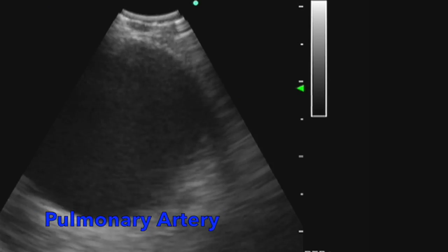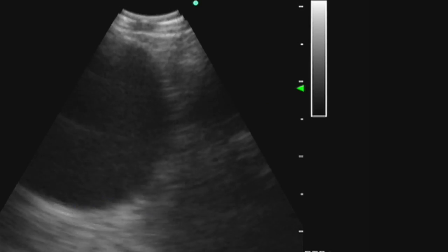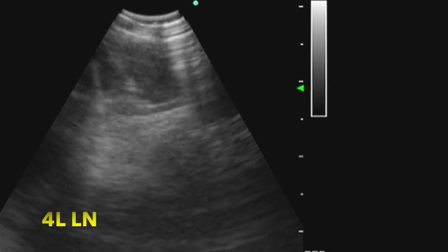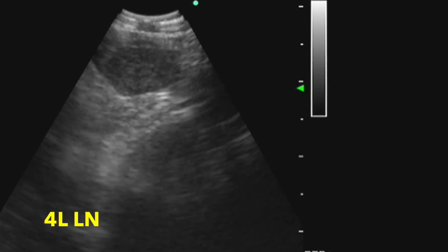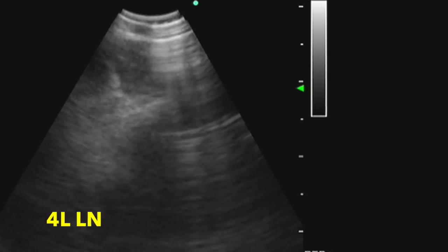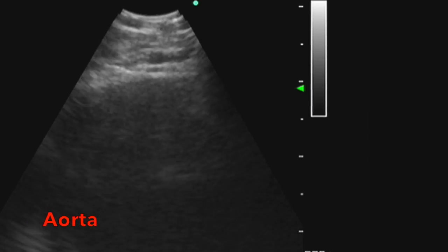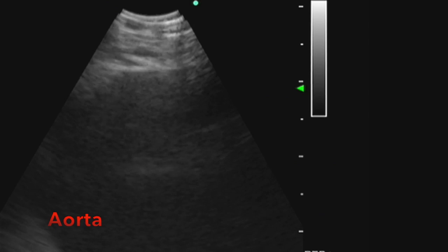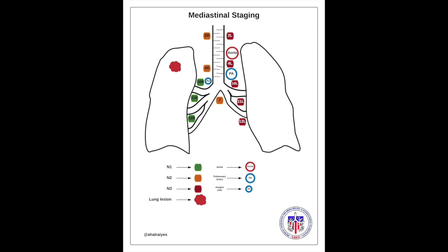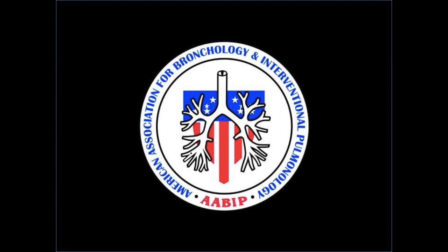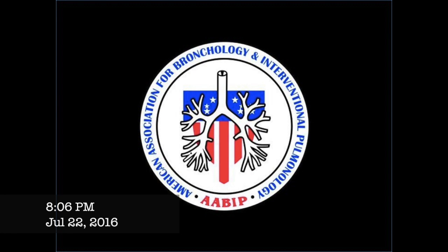Per EBUS, 4L is located between two large blood vessels: the pulmonary artery and the aorta. For this case, if 4L turns out to be positive for malignancy, this will be an N3 lymph node.